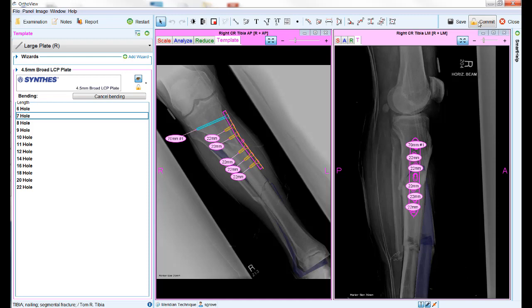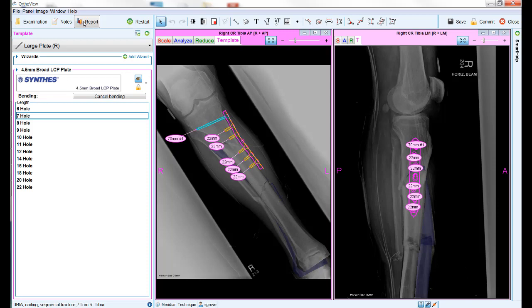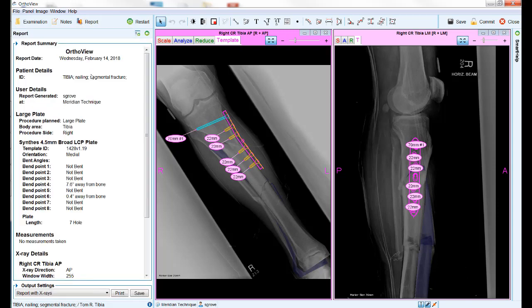As well as the templated image, the software will also store a report. This report can be viewed by clicking the report button on the top left hand side of the screen. There is also an option on the main toolbar to allow selected portions of this report to be displayed on the main x-ray view.